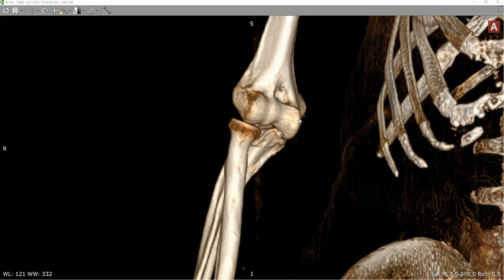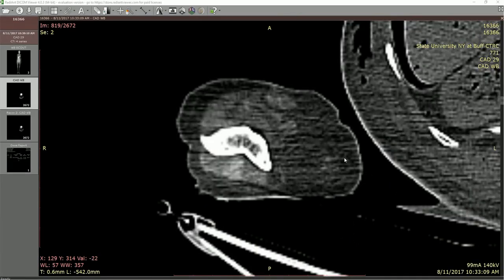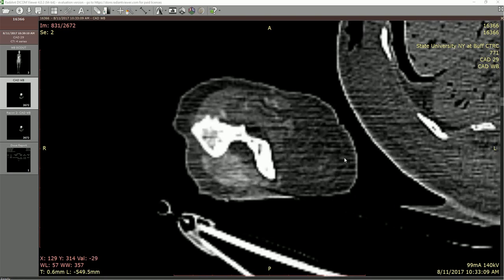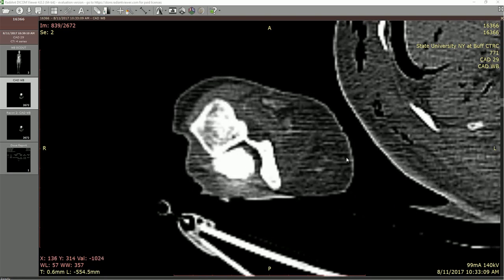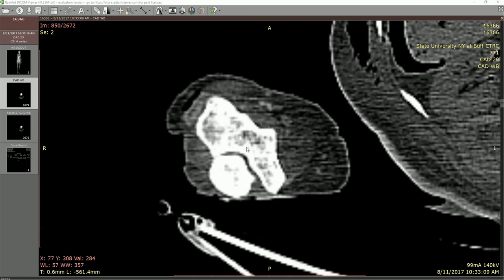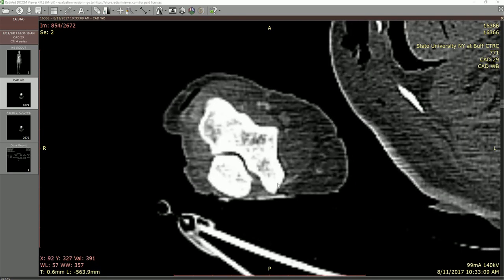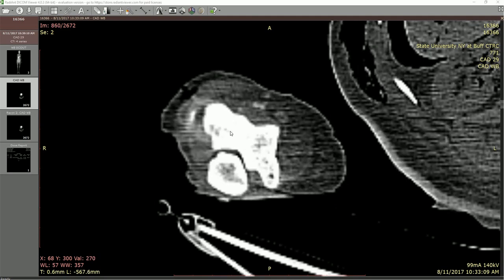We're starting to see the outline of the trochlea and the capitulum. As we go through, the radial head will start to appear and we'll be able to see that articulation with the capitulum. Scrolling inferiorly, you can see the beginning of the olecranon process off the ulna, fitting into the olecranon fossa. In this view we have the medial epicondyle — this would be the start of the flexor muscle group coming off of that. You should be able to see the outline of the trochlea and the capitulum on the other side starting to show up.